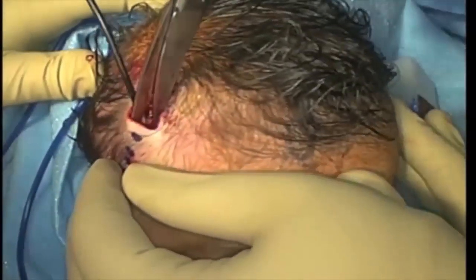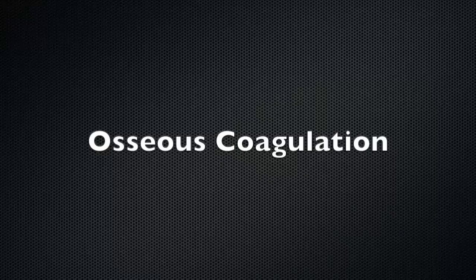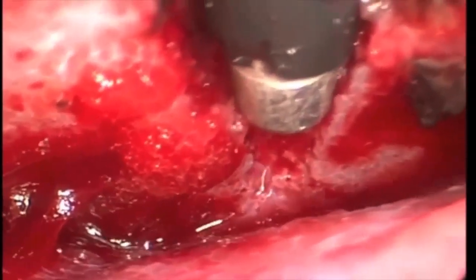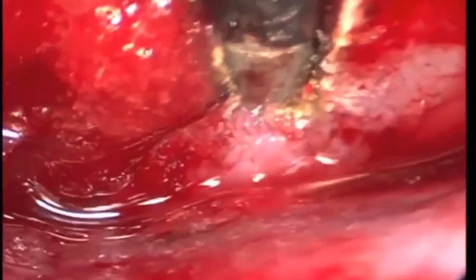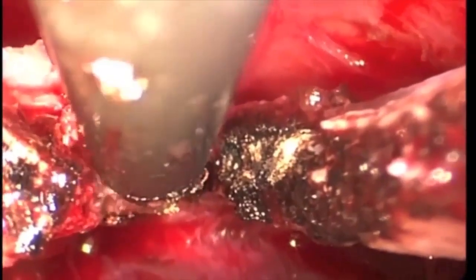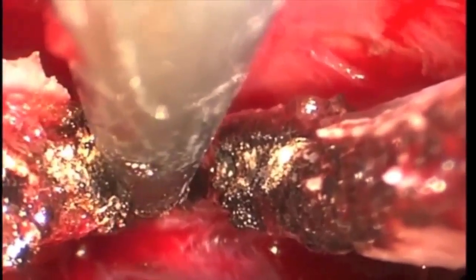Once the bone has been fully released, bony coagulation is obtained using the suction with the Bovie applied to it. You can see here the energy being delivered to obtain coagulation of the diploic space. This is done from inferior to superior and on both sides to prevent postoperative hematomas.